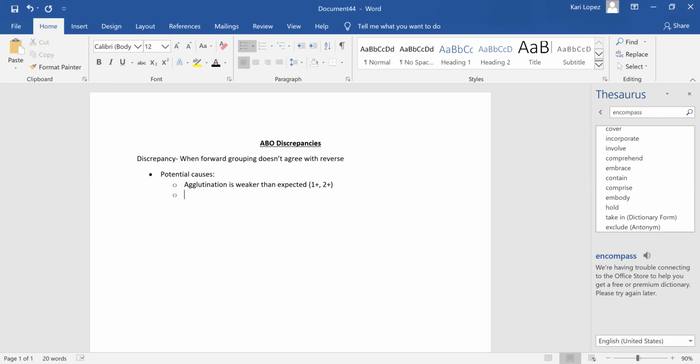Okay, so it should either be a 0 or a 3 or 4+ when you do the anti-B and anti-A and A cell and B cell, right? Correct. Okay, then I did something wrong in the lab because I got a.